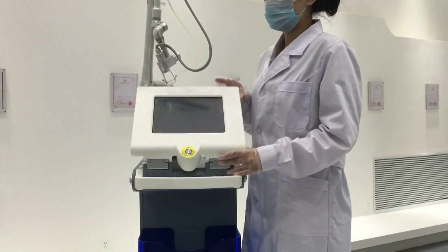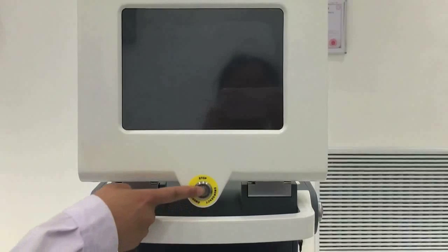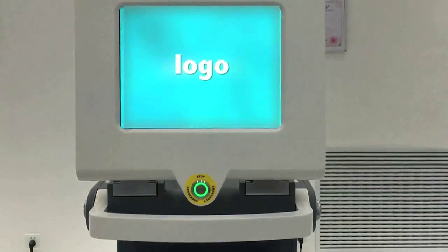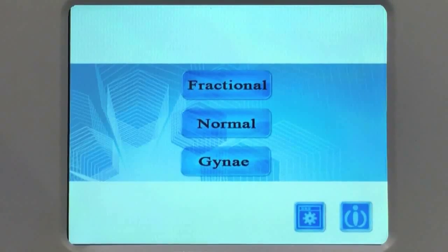Clockwise rotate the screen. Debugging: start the machine by pressing the button. After several seconds the machine turns on. There are three modes.